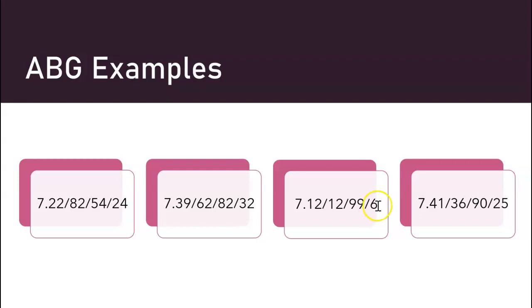And to compensate for this insanely low bicarb, because their body's trying to regulate their metabolic status, they'll be breathing as fast as they can to try to get this pH where it wants to be, because their body's trying to compensate. Their brainstem's working just fine. And there's not much you can do as the RT except notify her the results.